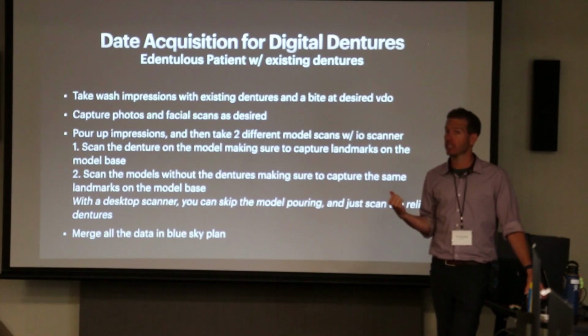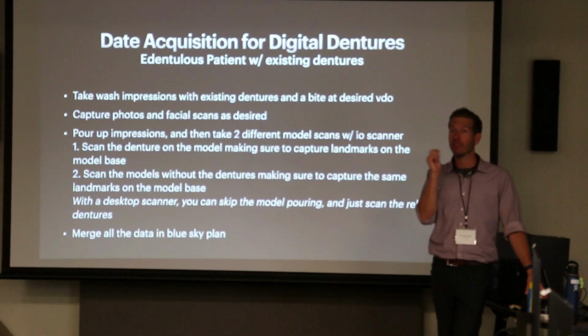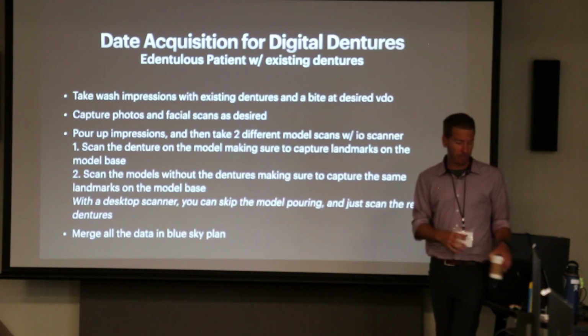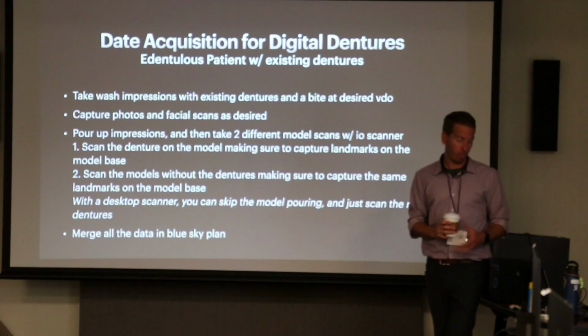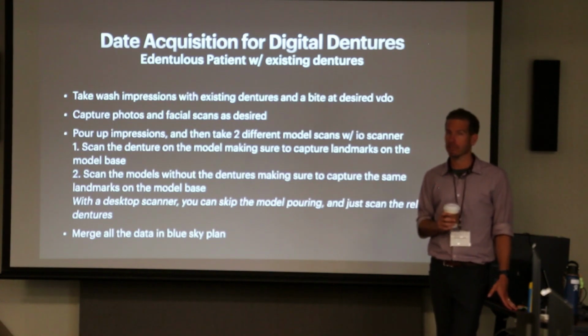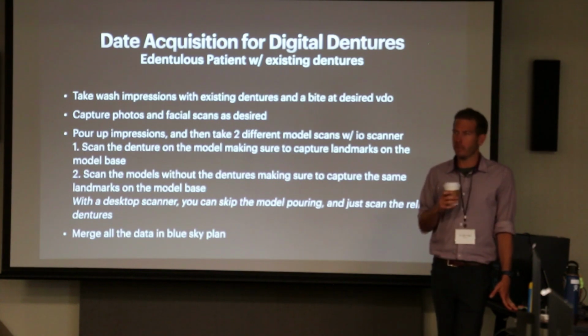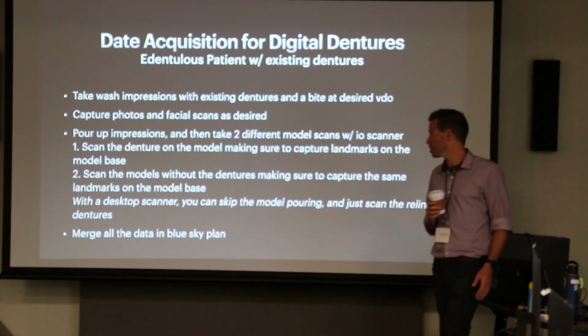With dentures. Yeah. So they come in with upper and lower dentures, they go, yeah, I get it, I want new ones. Scan them with the iTero in the mouth with their dentures, and then wash the dentures and scan them in the ray scan. Now you have everything. You have your posing, your bite, and your washed existing denture. Kind of hard to visualize probably without doing it, but once you guys start collecting this data, you'll figure out, oh yeah, okay, I need this, this, and that, and it's not that much.